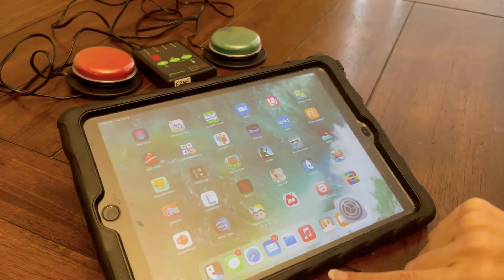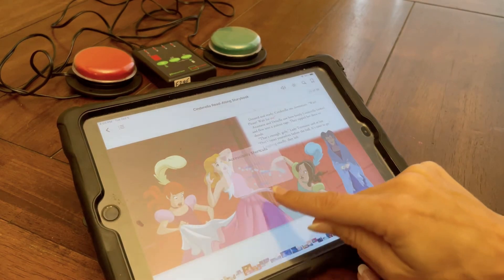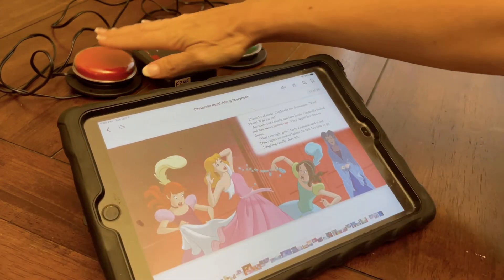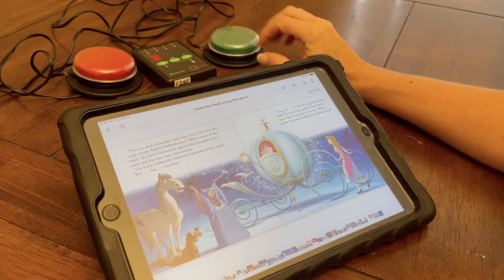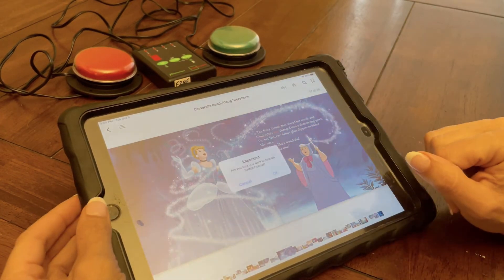Then, when I go into an application that needs to turn the page, I triple click and hit Switch Control. And now, when I hit the switch, it turns the page. I can triple click again to go out of Switch Control.